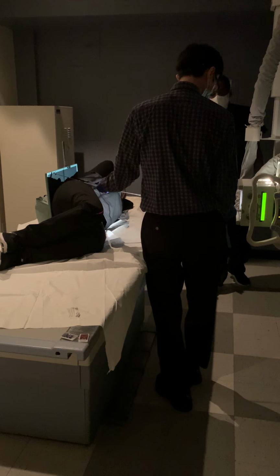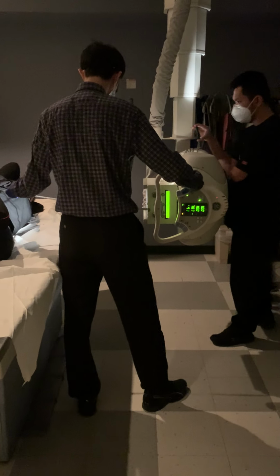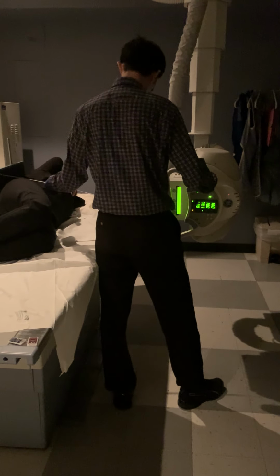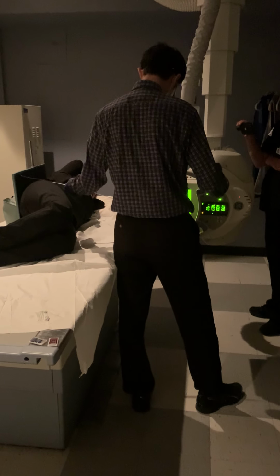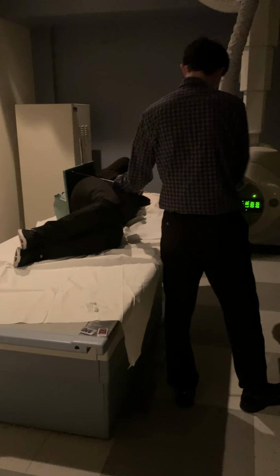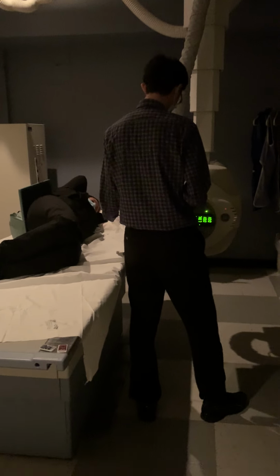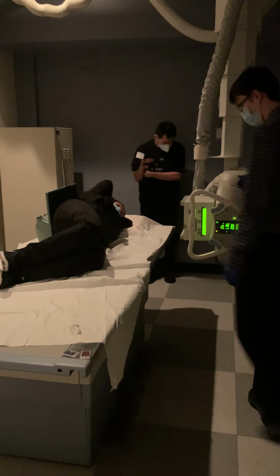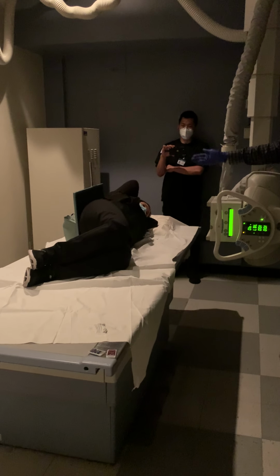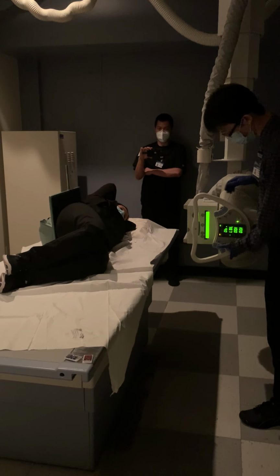Oh, I'm at 51. So I'm going to use my lateral. I'm going to bring this in nice and slow, keeping this straight until I reach 40. Alright, so tape measure was straight, and I'm at 40 inches SID. Okay, so I'm centered, I'm lined up, IR is lined up, tube is 40 inches away.